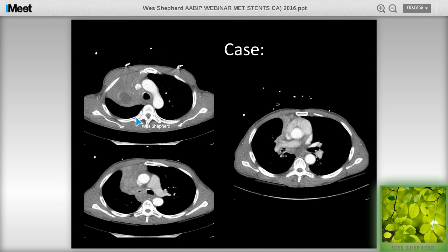And it lets me know that jailing or covering over the right upper lobe bronchus is potentially an option here. The other key finding here, as I already mentioned, is that I can see the distal airways. A lot of these cases I may not be able to discern on the CT scan whether or not there are viable, healthy airways beyond the obstruction that I can place a stent and actually salvage.